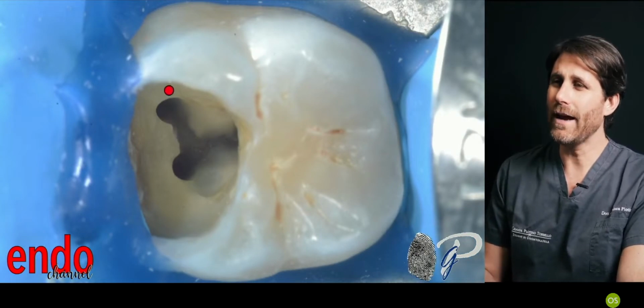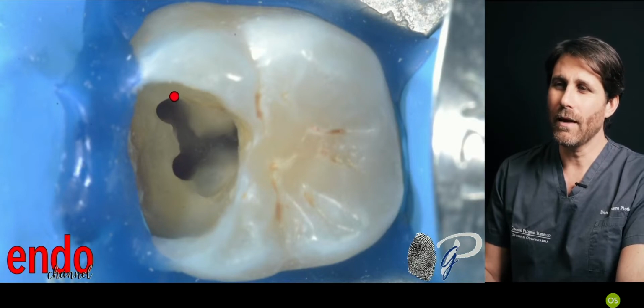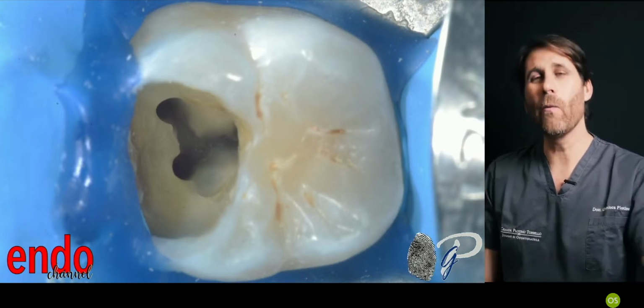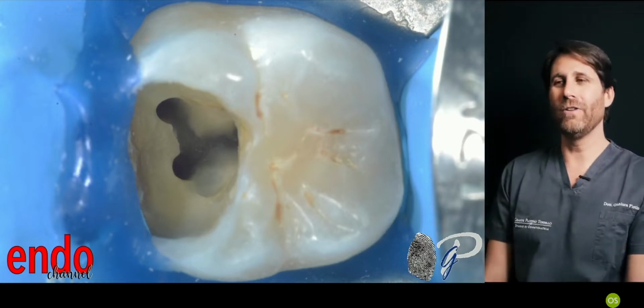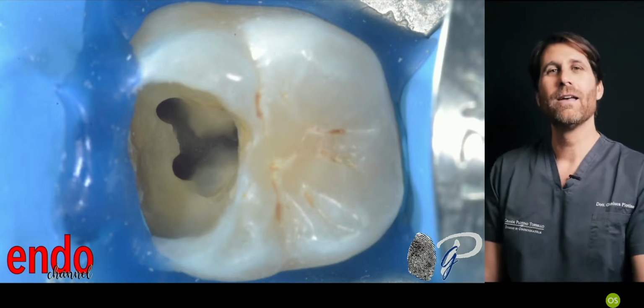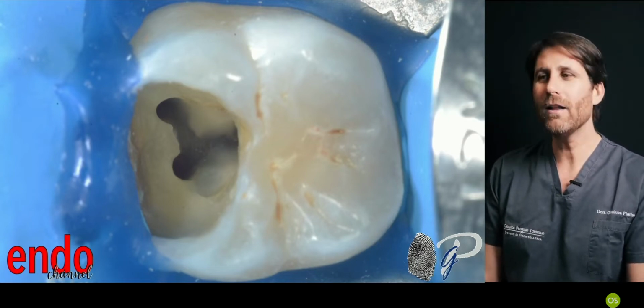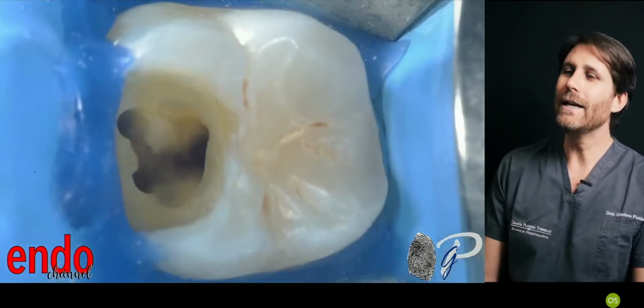the lines that connect the orifices to the mesial orifice to the distal one, and we will see how to follow these lines and these anatomies in the orifice location part in this channel, how to follow these rules. And this is the distal canal.